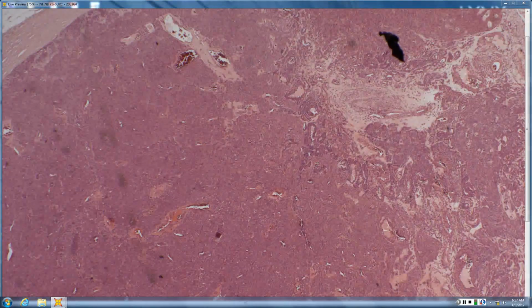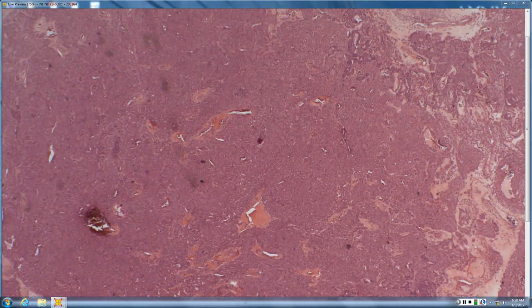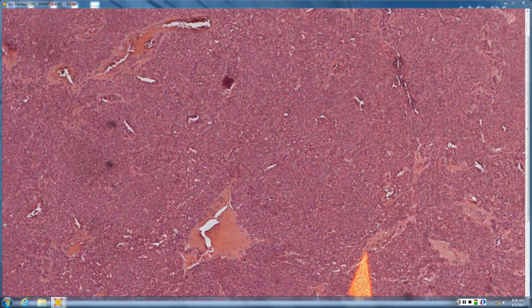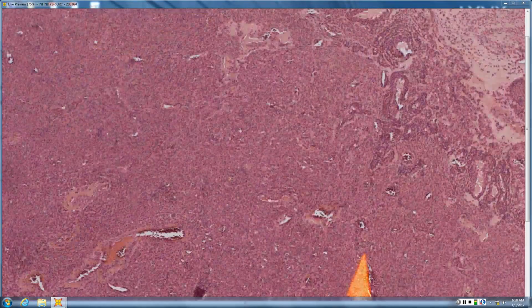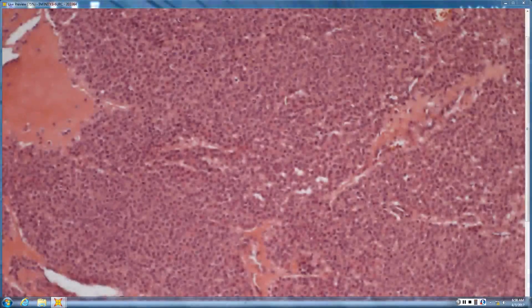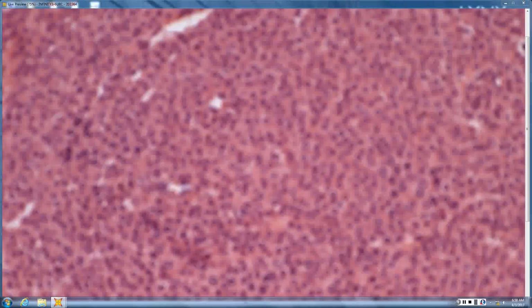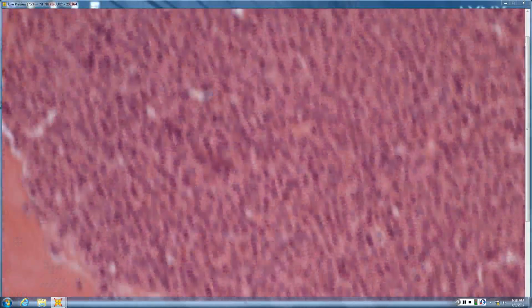And here from scan, you might be thinking, any type of proliferation. Certainly there's vascular spaces in here, but it's not until you get a little bit closer that you can start to make out this monotonous appearance to these cells, and they all kind of look the same. They're all very round and regular appearing. I mean, they're very evenly spaced. They have a characteristic appearance to them.